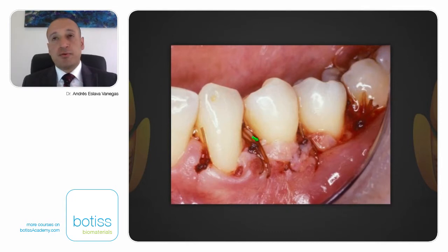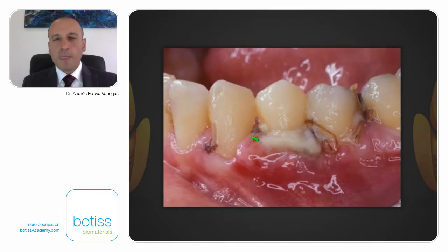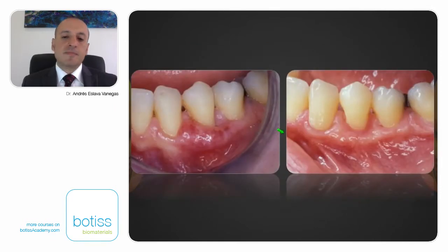Okay, this picture is from maybe 8 to 9 years ago, so you can see the flap is not raised so well. There is some tension on this flap, but okay, this is part of the story. Two weeks later, this is the appearance of the healing of this patient. Okay, you can see the papillae are really good. But in this area, where the connective tissue graft was exposed, you can see this white area. So you may think it could be necrosis, or what is going on there? But one month later, when we removed the sutures, we can see granulation tissue in this area.